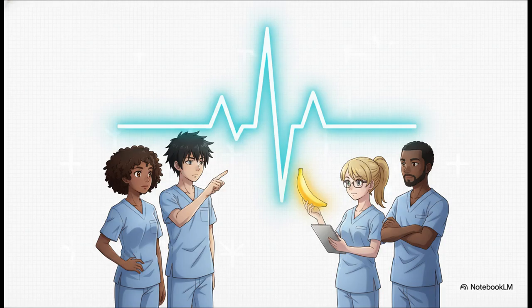That huge spike right in the middle, that is the QRS complex, representing ventricular depolarization. It happens fast, taking only 0.08 to 0.12 seconds. Then we have the PR interval, which is the travel time from the atria down to the ventricles. Normally that's 0.12 to 0.20 seconds.